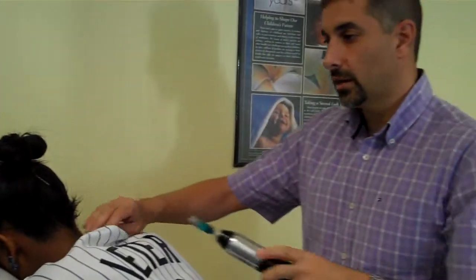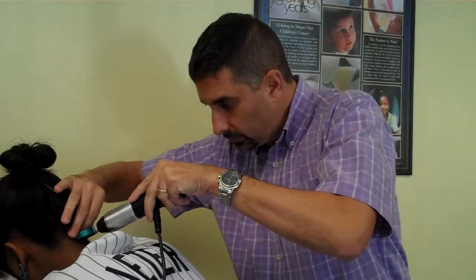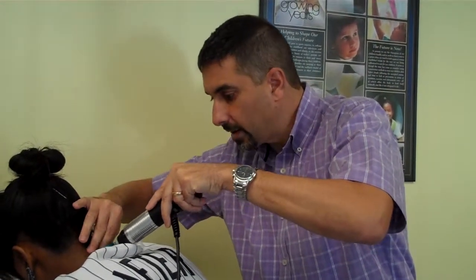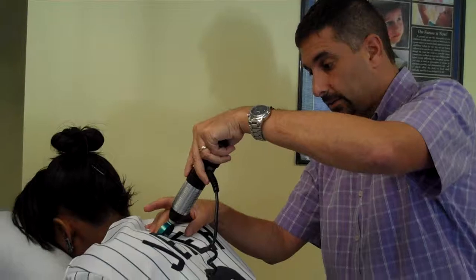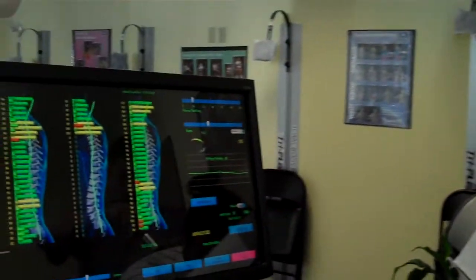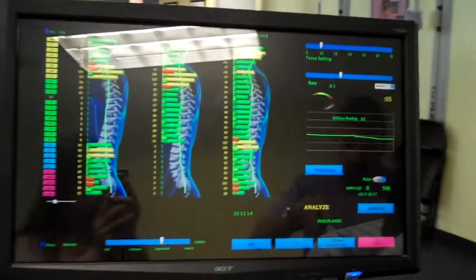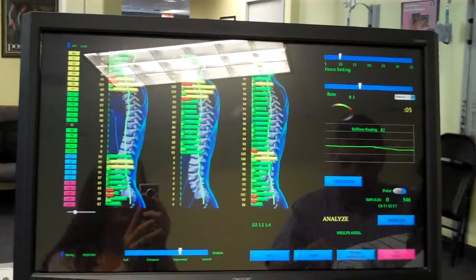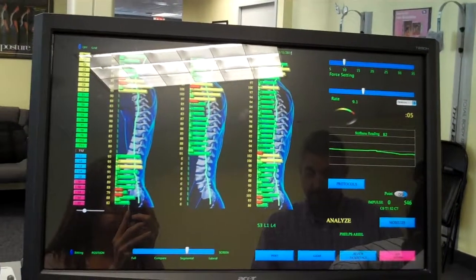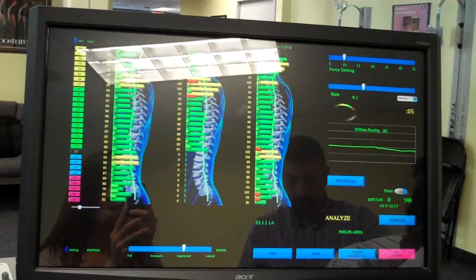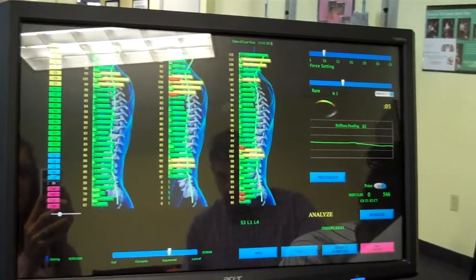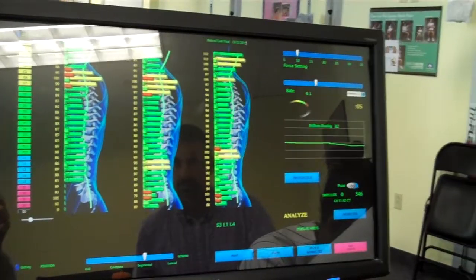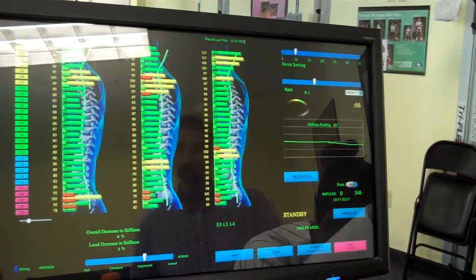Now we're going to reanalyze the same way that you did right out of the gate. And we can look at the screen now. As you watch the screen, we're going to get the new evaluation coming up.